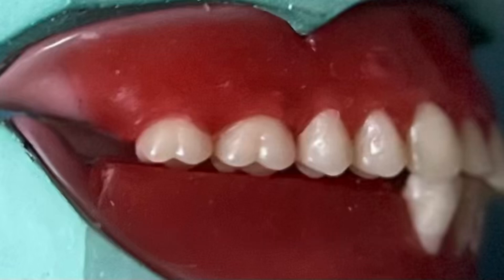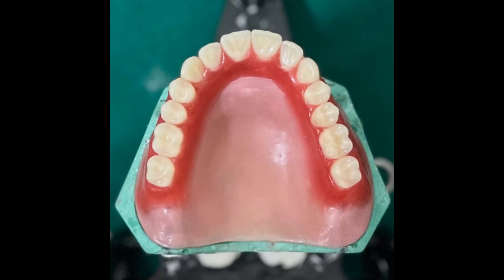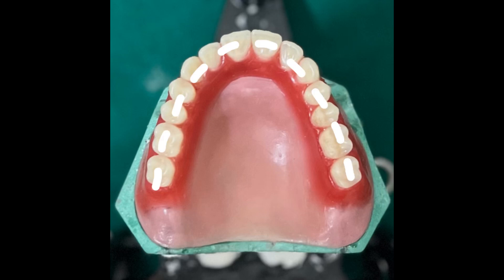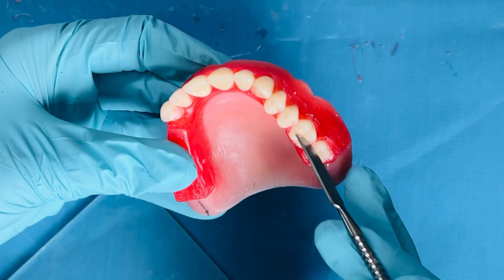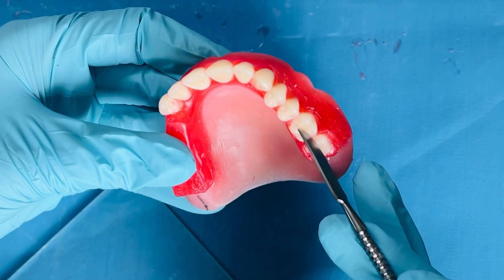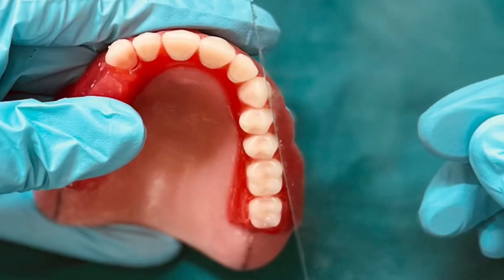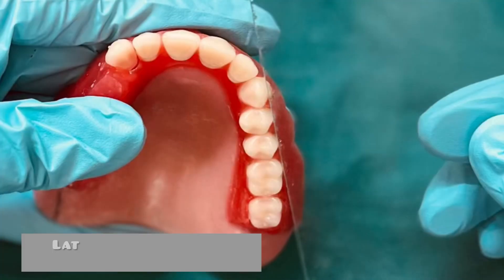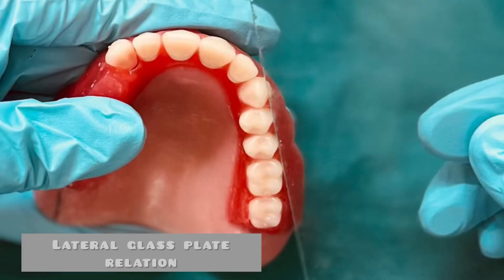This will automatically come true if your inclinations are set correctly. You can also turn and check the occlusion from the palatal aspect for a better view. Close the articulator and make sure that the palatal cusps of the second molar are approximating the reference line drawn on the lower occlusal rim. This will ensure that the arch form is maintained and both our maxillary and mandibular posterior teeth will be centered on the ridge. Moving on to lateral glass plate relation.